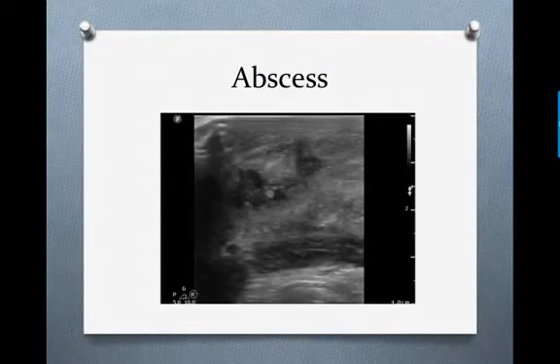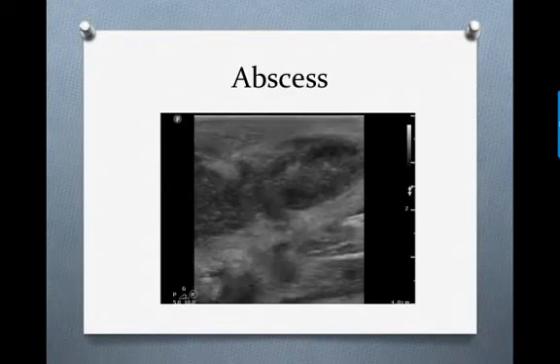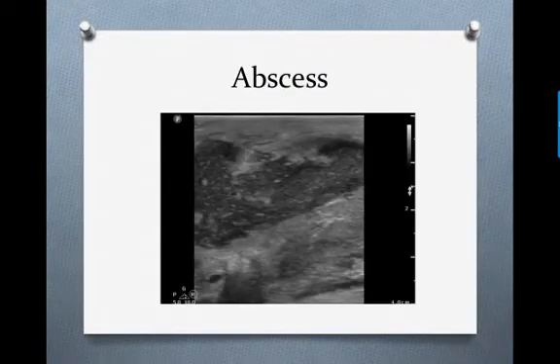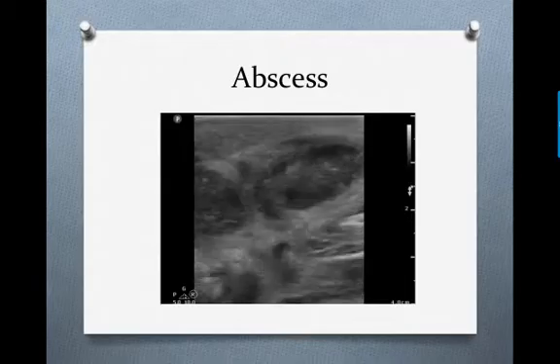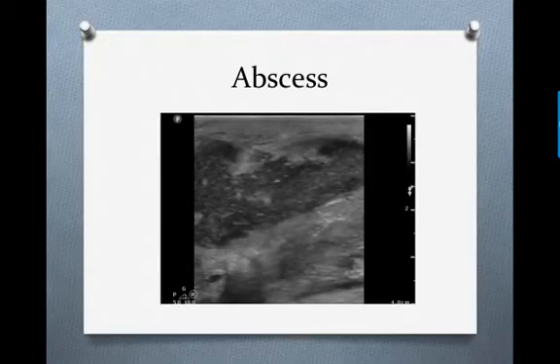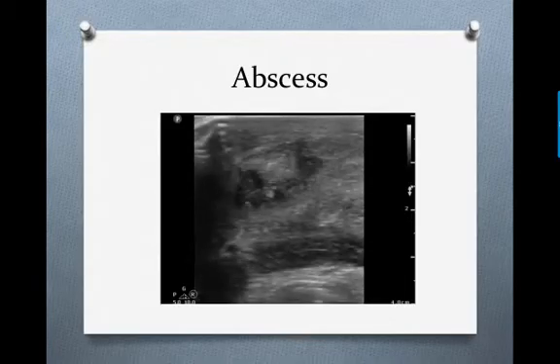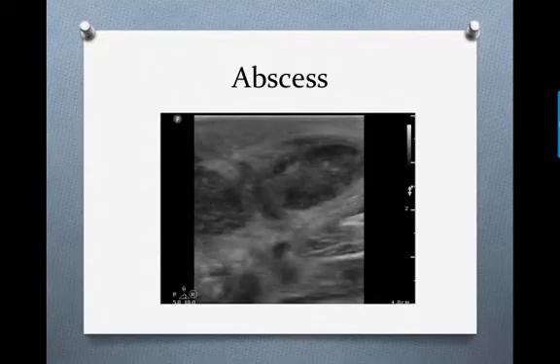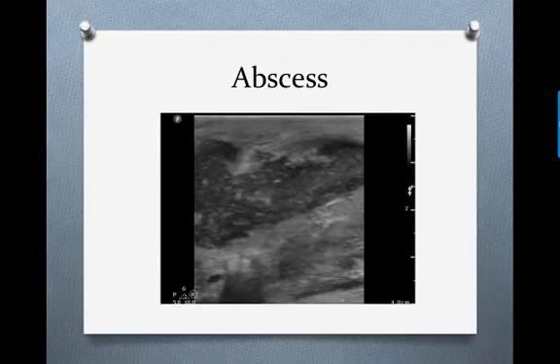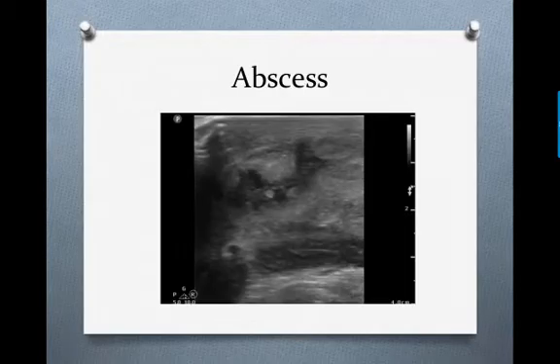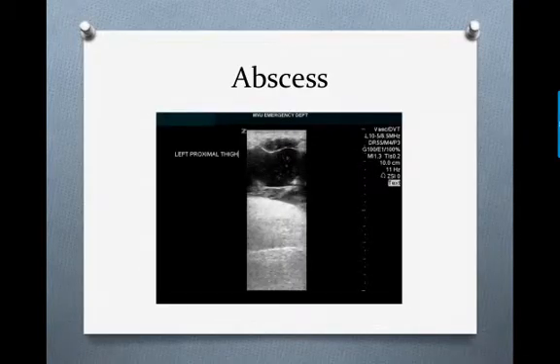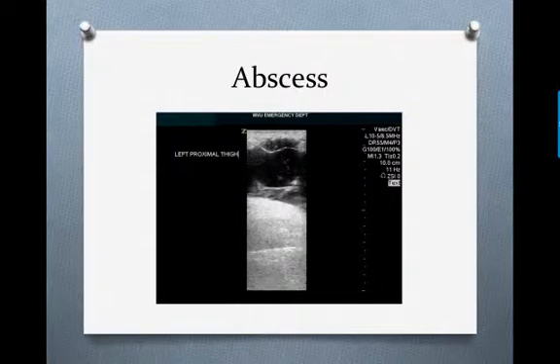This is the appearance of an abscess. You can see a complex fluid collection with very irregular borders. Here's another example of an abscess — this is called pusostalsis, where you can see the pus swirling around within the abscess itself.